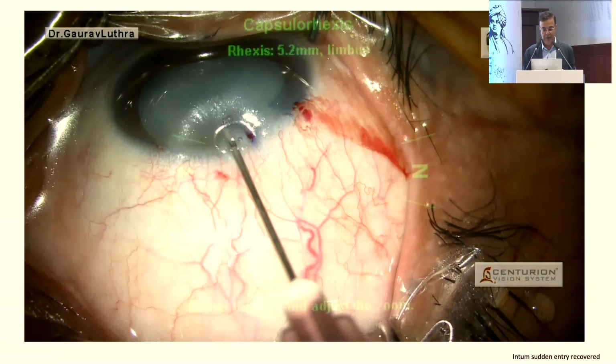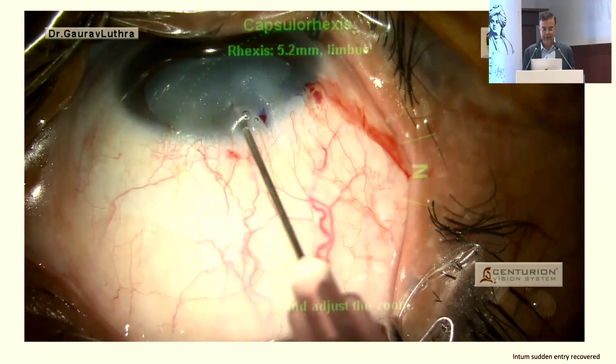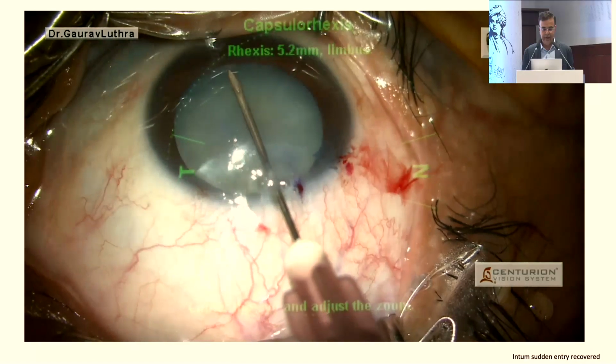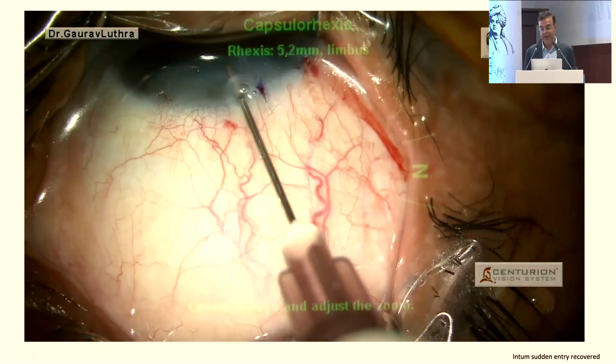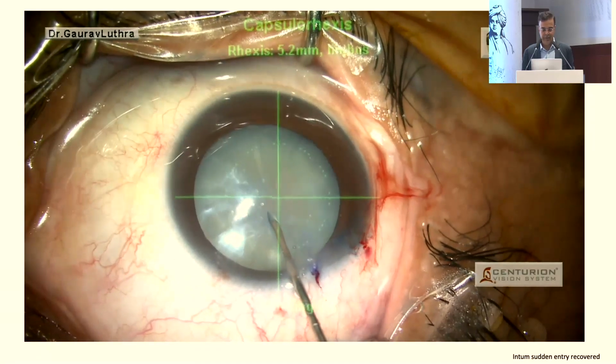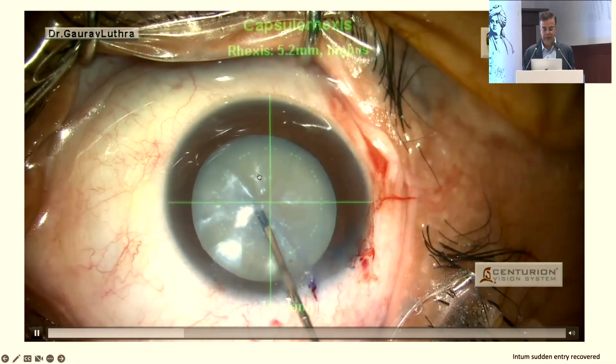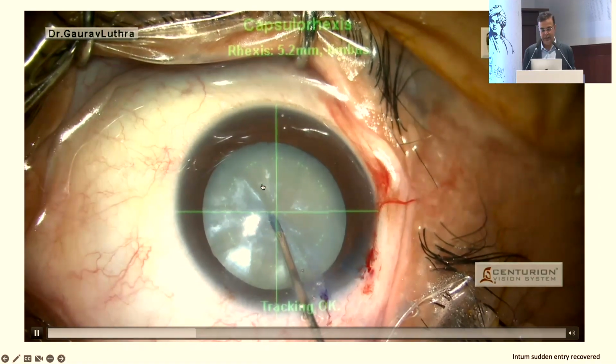And I thought my needle was sharp enough. I like to go in from a closed paracentesis chamber with full viscoelastic inside to decompress the lens and just see what happens. There will be a sudden entry. There it goes, and it punctures and makes a radial incision on the capsule. So now I have a radial incision over there, and I have to bring it back. So there is this long incision from the 26 gauge needle that I was using.